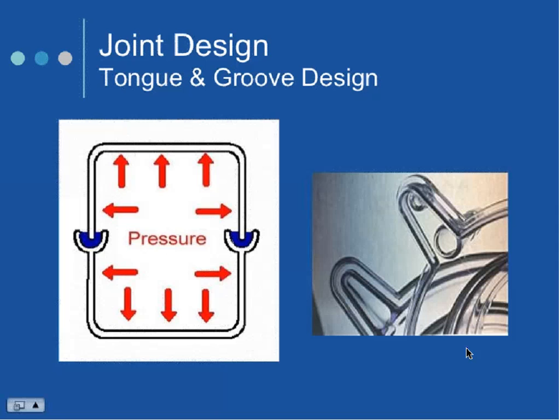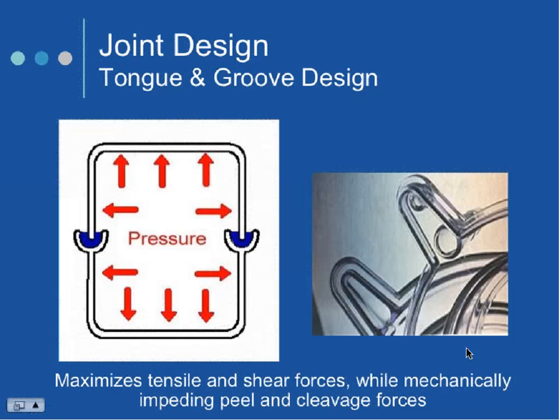We don't see them as much as we'd like to, but they're just wonderful for adhesives, especially if you're working with light-cure acrylics, because you have this groove that runs around the perimeter of the device again, and now the tongue comes down, engages, and plows up the adhesive on either side, and that way your adhesive is not as critical as to how much you have to put into the joint, number one, and number two, more important, it maximizes your tensile and your shear while it minimizes the peel and the cleavage. You see how that works? So it's a great design if you ever get a chance to design for that. And a close-up of a particular design on a filter device, an arterial filter, is on the right-hand side, just so you can get a sense of what that looks like.